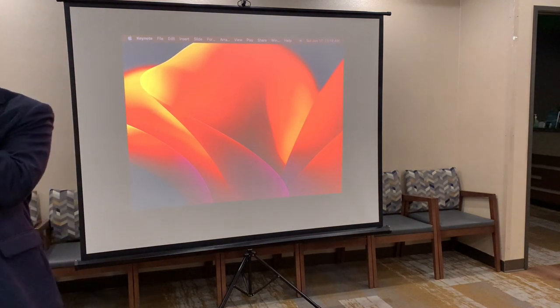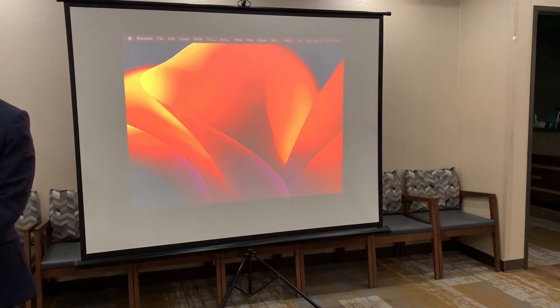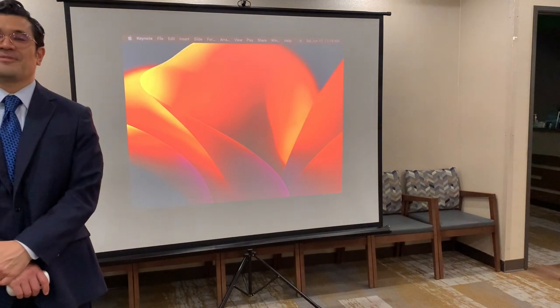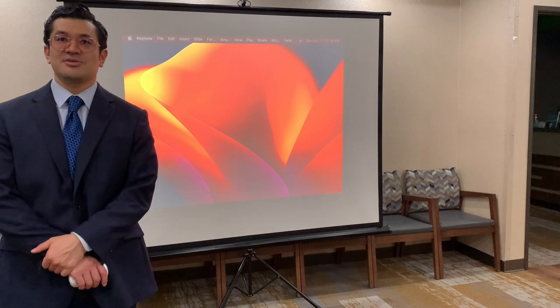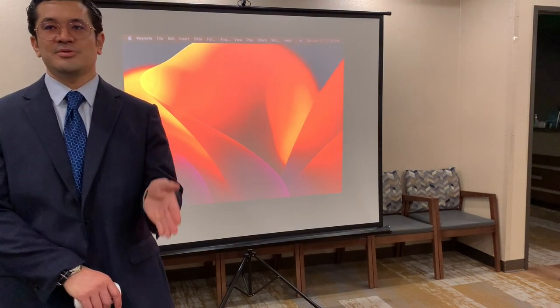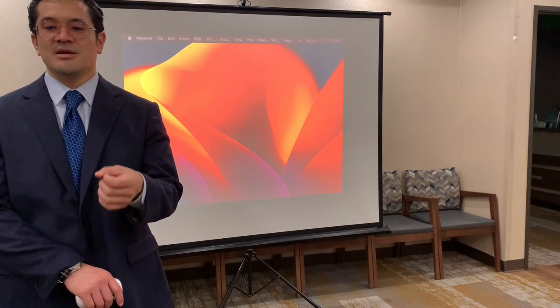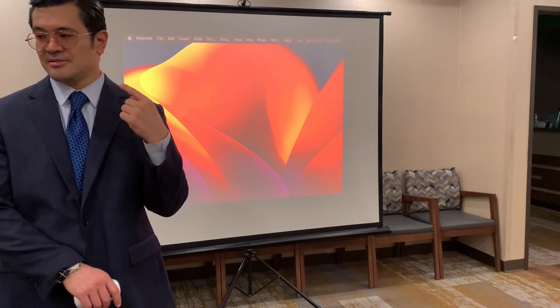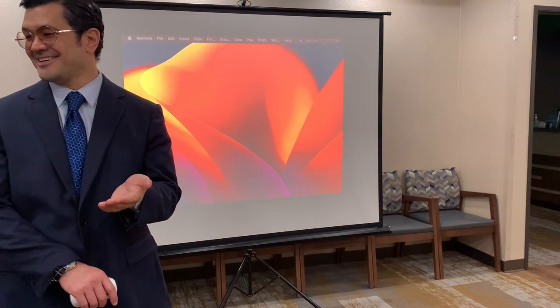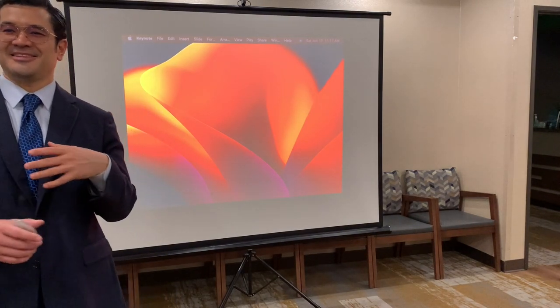When you have a patient with cataract and prism, what type of lens are you going to use? Would you stay with basic? They have to wear glasses anyway? Absolutely, great question. If someone's in prism, what do we do with the lenses on cataract patients? Well, there is currently no prism lens implant. What if we do get that? I think that would be fascinating, because now we'd have a toric prism lens.